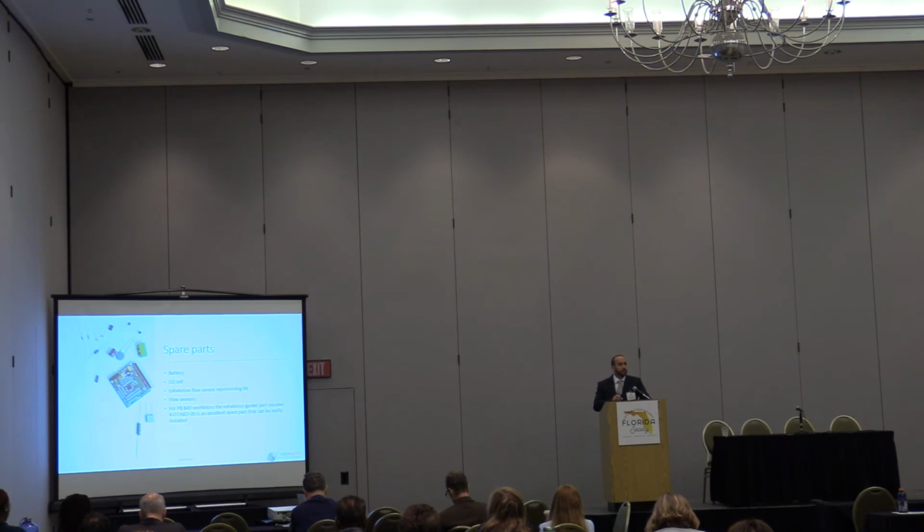Just some things for them to keep in stock, just so that if there have been a lot of issues with supply chain. Sometimes you're looking at a few months to be able to get components that are critical for your ventilator. So at the very least, if you have a few, it does buy you some time, so you can pull it from stock, place the order to replace that, but keep your ventilators in service without interruption.